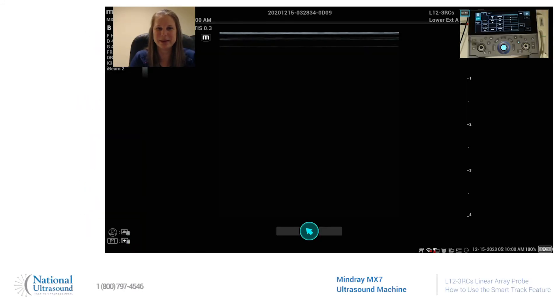Hi, my name is Jackie Klebeck. I've been a registered cardiac vascular and general sonographer for eight years. I'm here today at National Ultrasound on a Mindray MX-7 using an L12-3RCS linear probe, and today I'm going to show you how to use the SmartTrack feature.